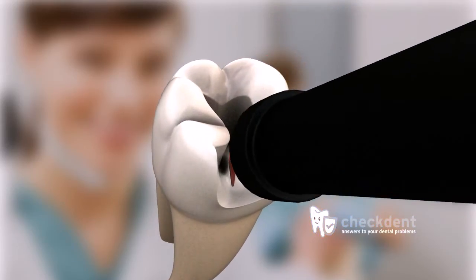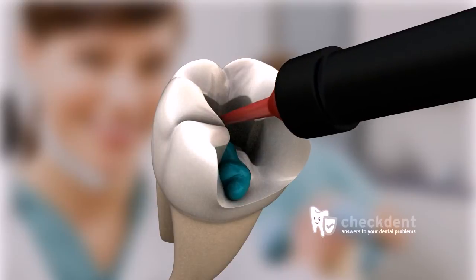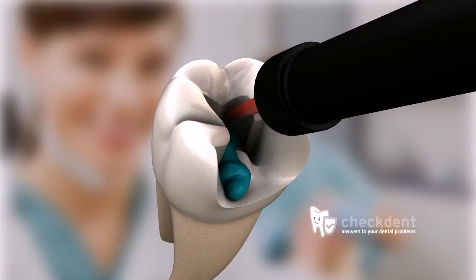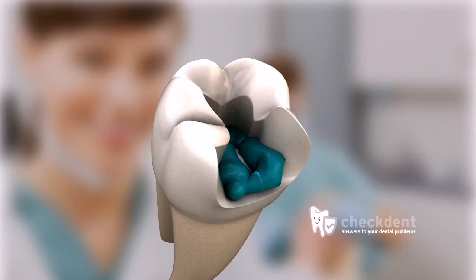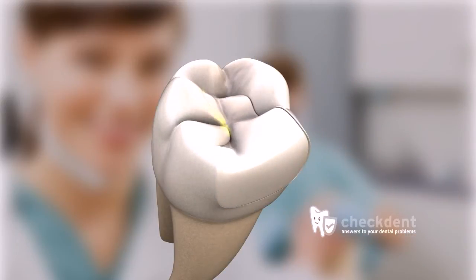Bonding is an informal term used in dentistry to describe the gluing procedure of ceramic and or plastic fillings. In contrast to the cementing process, surfaces to be glued must first undergo a special preparatory treatment. Let's take a look at the individual steps.